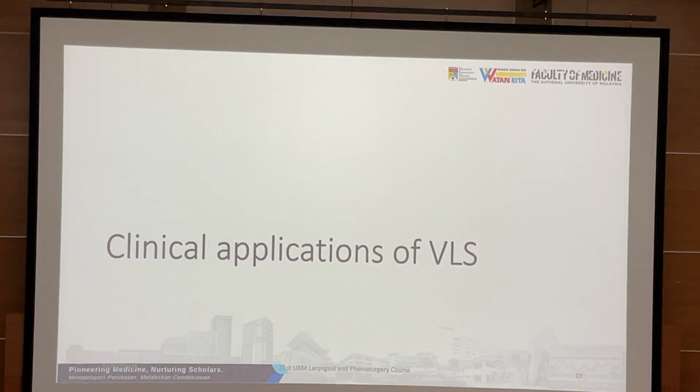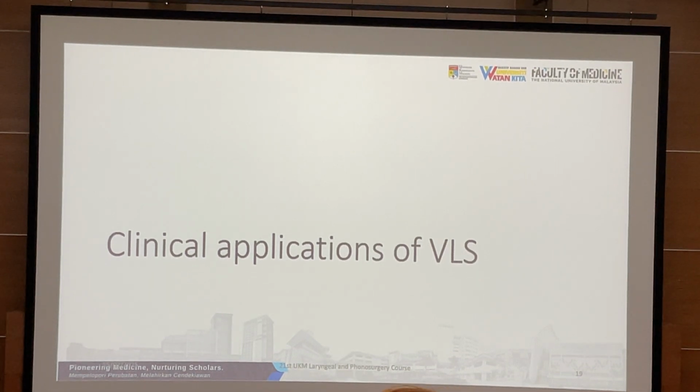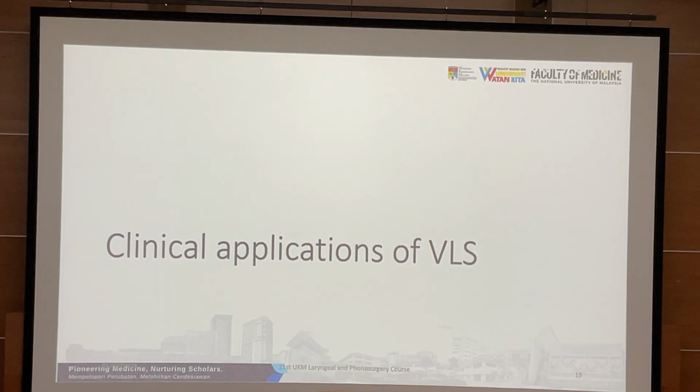Right, now we talk about what are the clinical applications. Why are you so bothered about having video laryngostroboscopy? Dr. Yakubu, in the UK, for you to run a voice clinic, it is a must for you to have video stroboscopy. Am I right? So it is around the world.